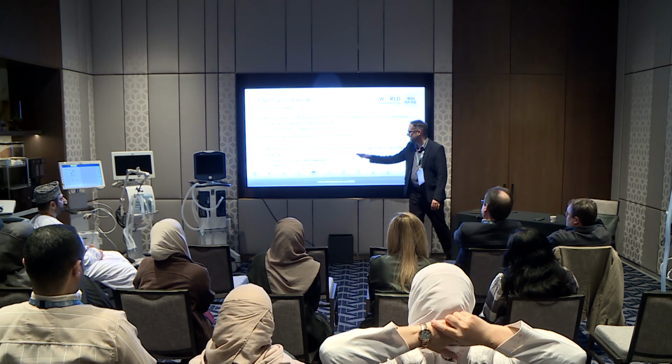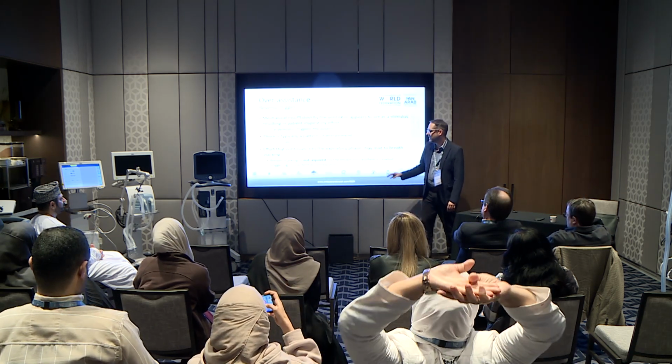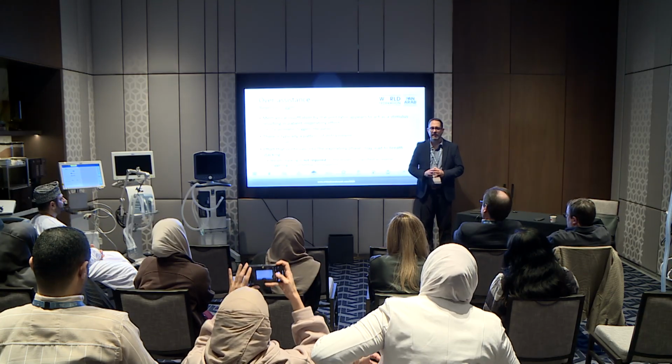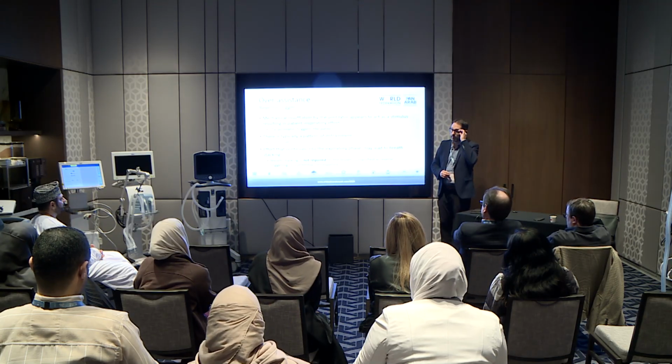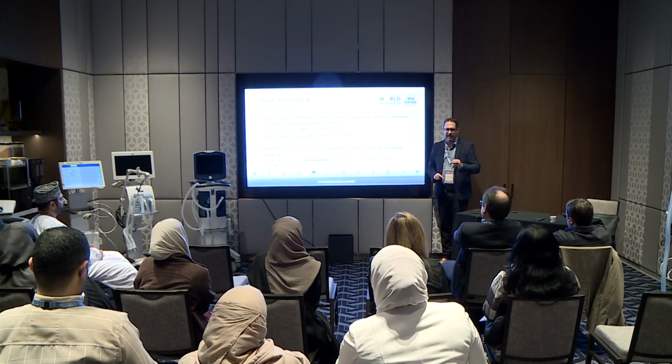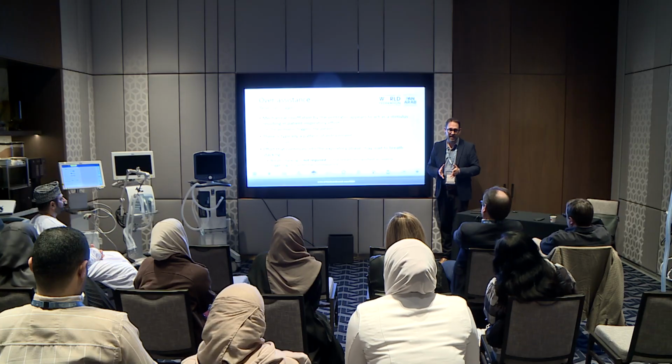The effort that continues into the expiratory phase may lead to breath stacking, but it's not a requirement for you to call it reverse triggering. This is important because some people, I read a paper years ago where they defined reverse triggering as a patient effort that caused a second breath. So that's not the case.